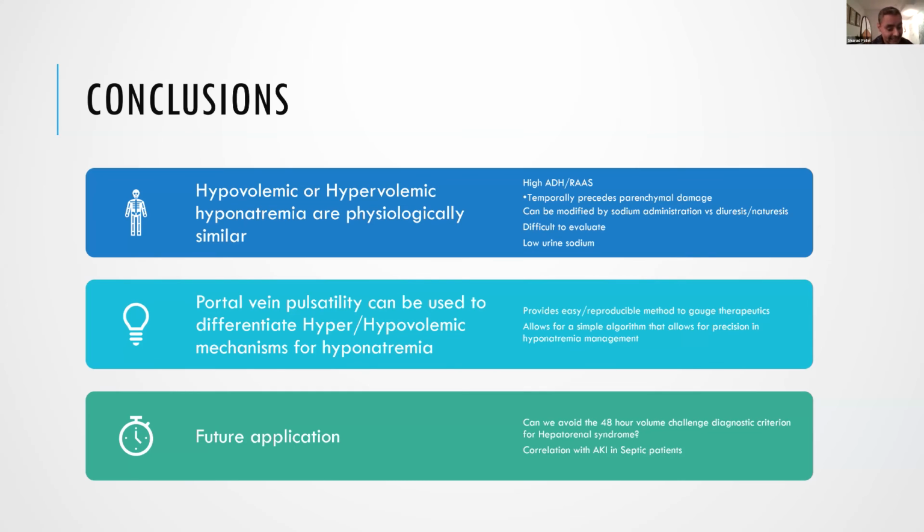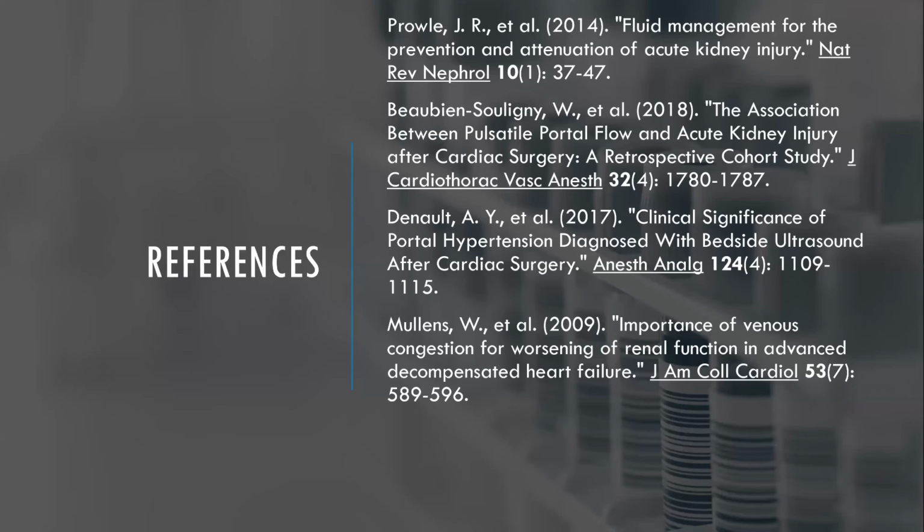But what I found, at least 75% of the time, and I keep a log of this, is that the ultrasound findings, my evidence, is opposite of what the bias was, which is over diuresis. It's actually that we haven't really even started diuresing the patient enough, and most of the time when you restart the diuretics again, because when the creatinine rises, one of the first interventions is to stop the Lasix. It's a constant thing that I'm fighting with. But most of the time, based on my findings, we just haven't diuresed enough.